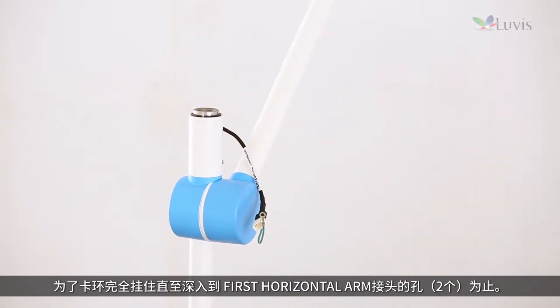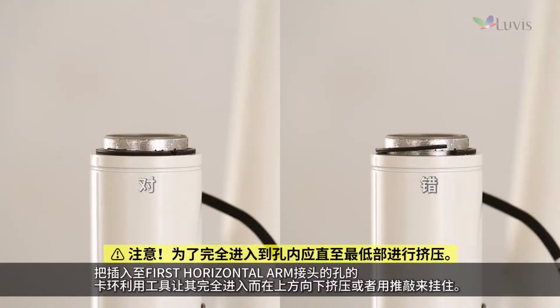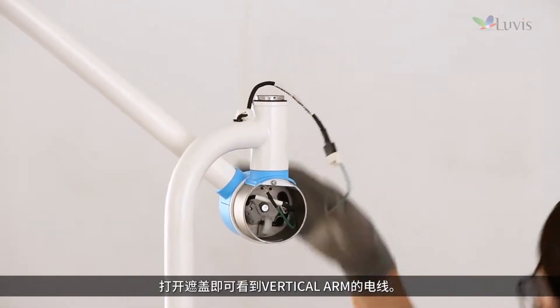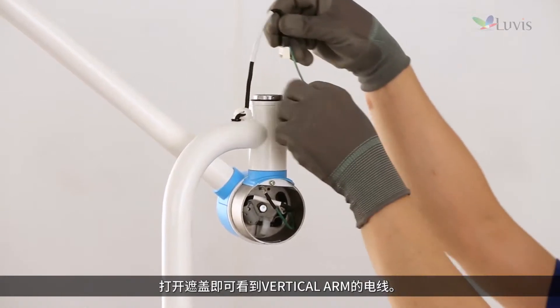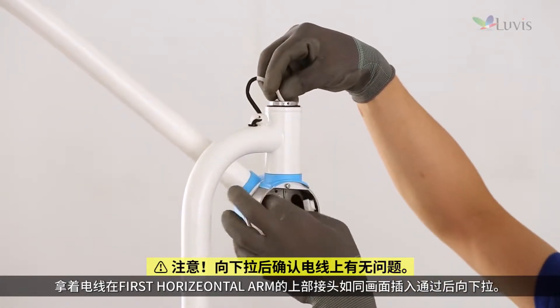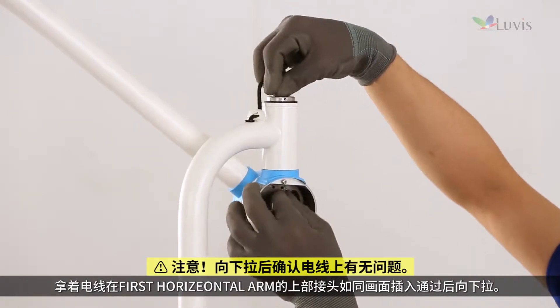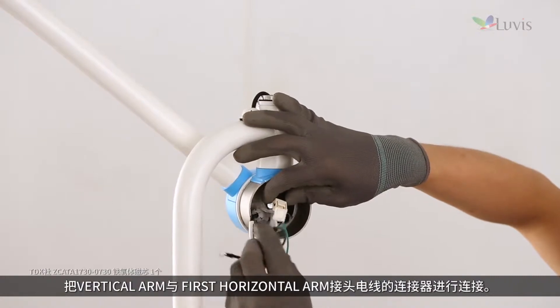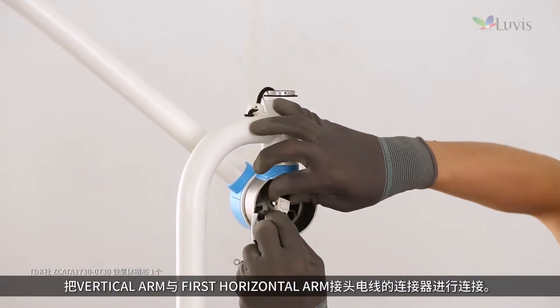Push the snap ring all the way into the grooves of the first horizontal arm joint to make sure it is completely hooked. Press down or tap the snap ring with a tool to ensure it completely reaches and inserts into the joint groove. Open the first horizontal arm's tension housing cover. Hold the wire and insert it into the first horizontal arm's upper joint to pass through, then pull it down to the bottom. Connect the vertical arm to the first horizontal arm joint wiring.